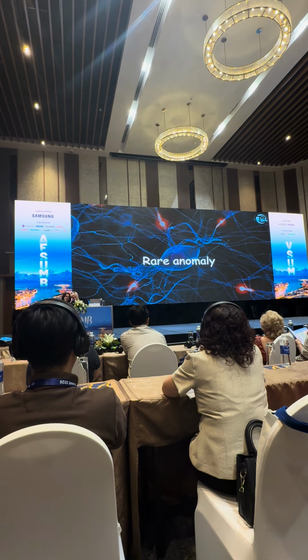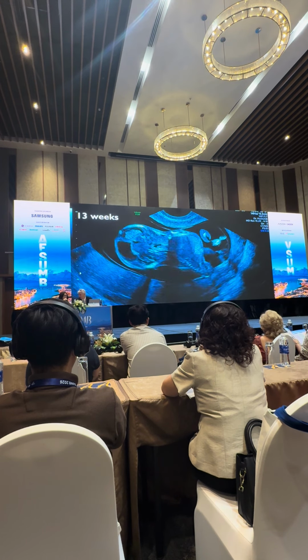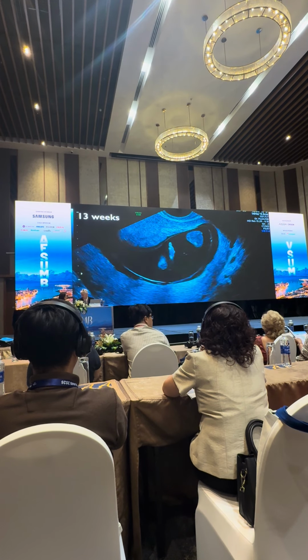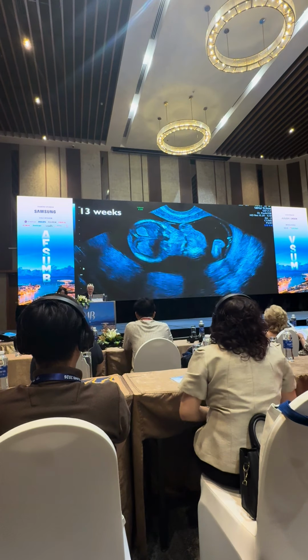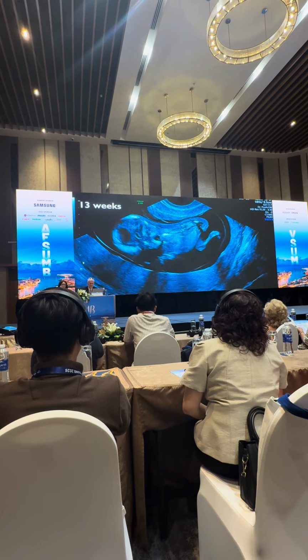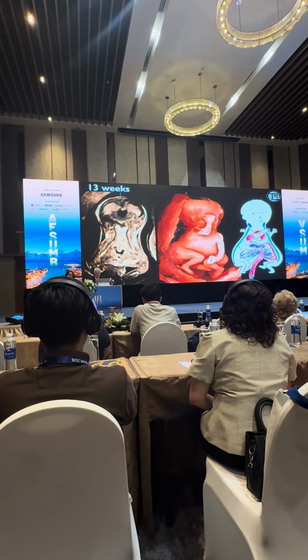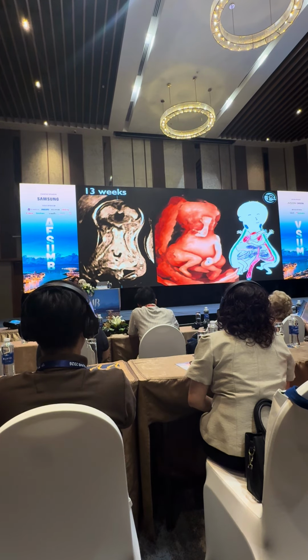Now, a rare anomaly here. What is this? What is the brain? So this is a very abnormal baby, and maybe in Vietnam many conjoined twins are seen, but here you can see this is 13 weeks of gestation. This is the conjoined twin.